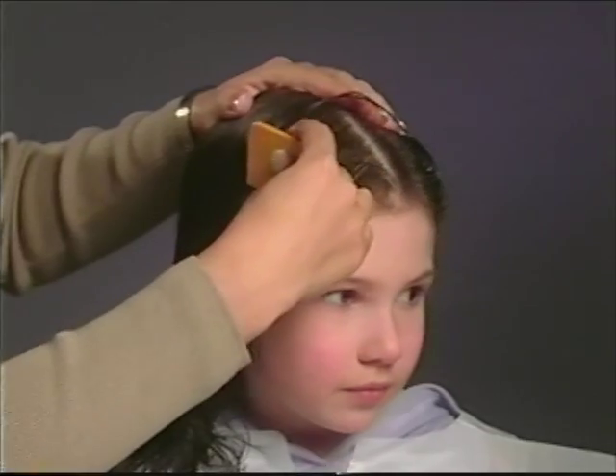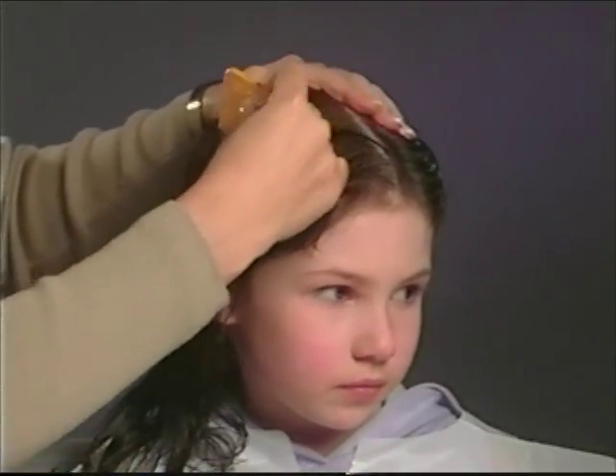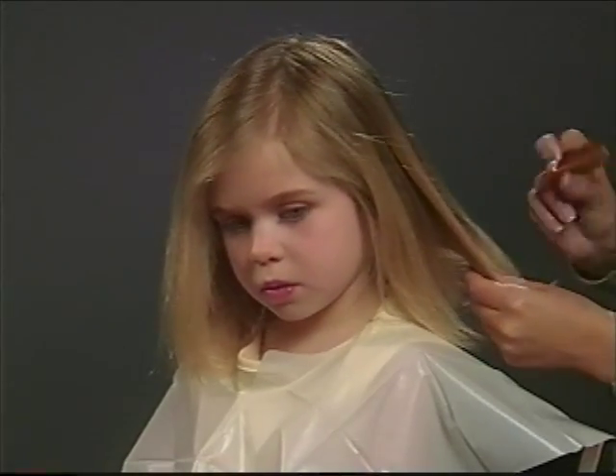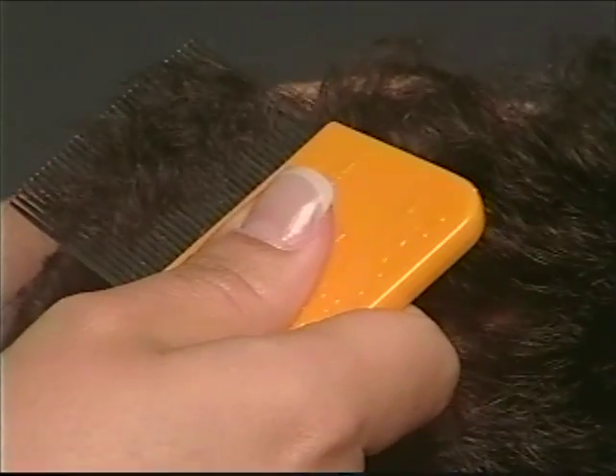By running your Leismeister comb through the hair, you'll be able to see whether any lice are present. You'll clearly see them on your comb, even if you can't see them in the hair. Work the hair in small sections, combing out each section individually.